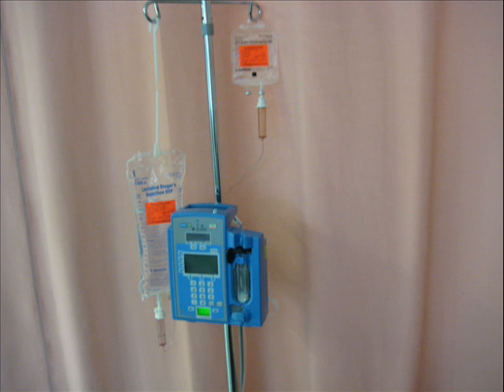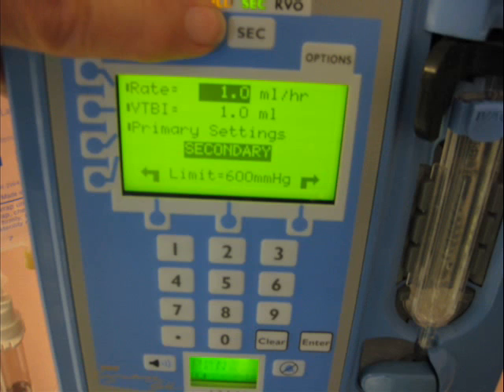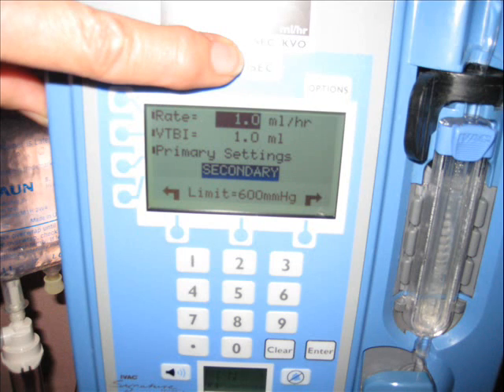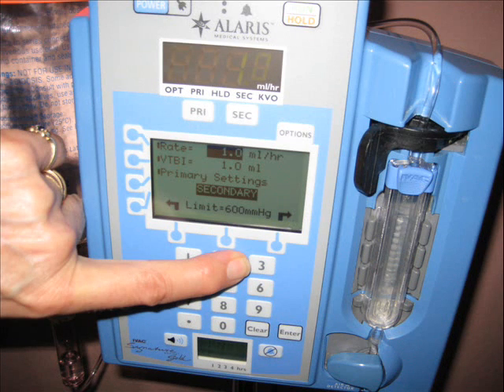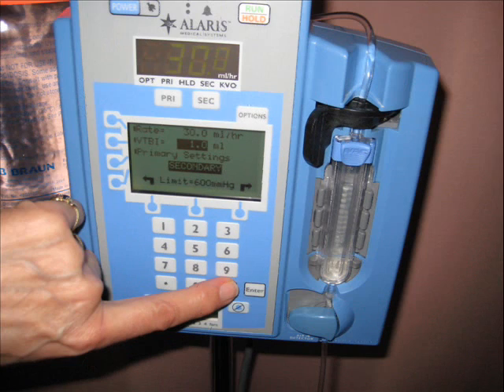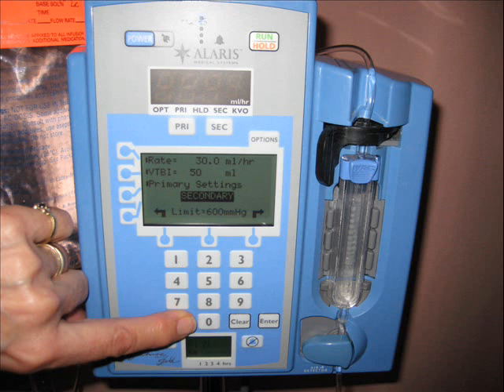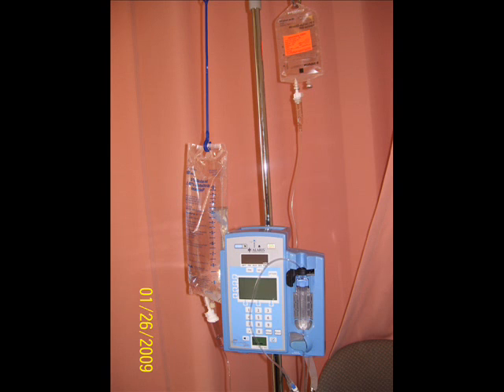We first clean our port with alcohol to ensure sterility. We then place the primary bag below the secondary bag so we can ensure the secondary will run. Press the secondary button — you can see the rate is now highlighted; it shows only one CC per hour. We will change that to the desired amount by pressing the number buttons to get the prescribed or calculated rate. Press enter — our rate is 30 CC per hour. The volume to be infused is now highlighted and we enter 50 CC. After that, press the run button. Be sure the primary bag is lower than the secondary bag, otherwise it will not run correctly. Good luck setting up your IV lines.